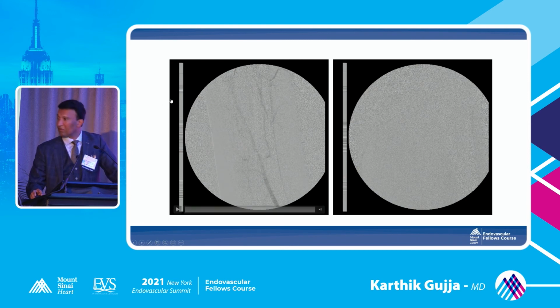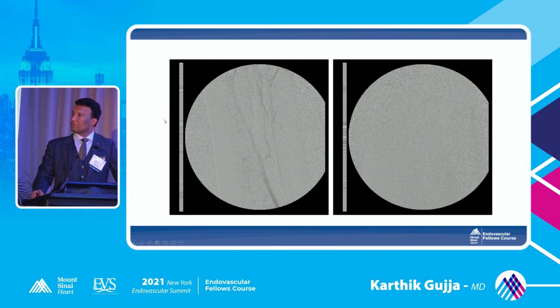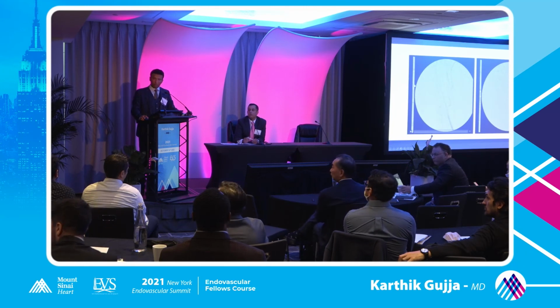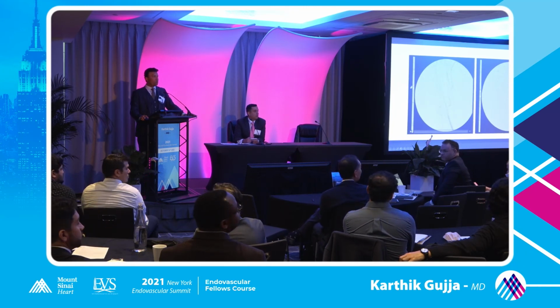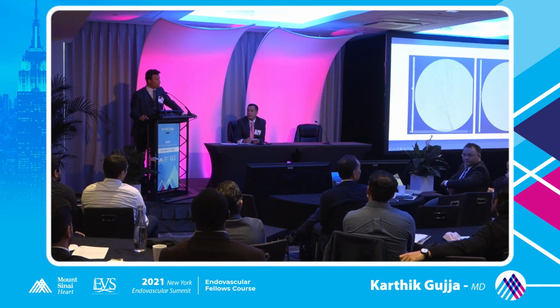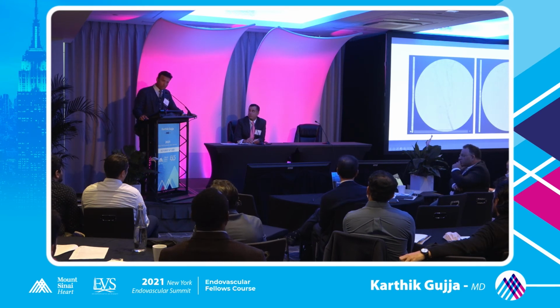So they have a question. Using a filter with an atherectomy device, does that mean that you're limited to using the Medtronic device, or can you use something like the CSI? CSI requires a micro-wire. Can you use different wires? So the question is, does using a filter limit the kind of device you're going to use? Yes.